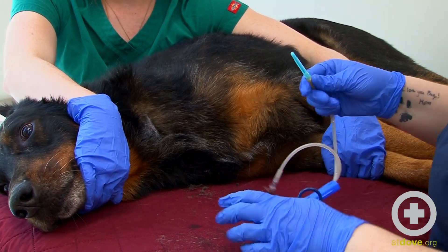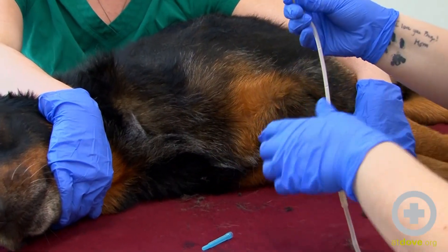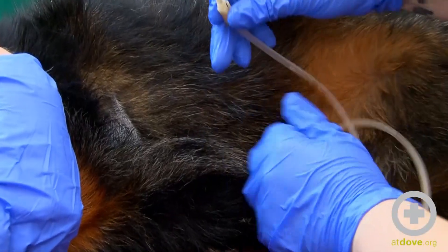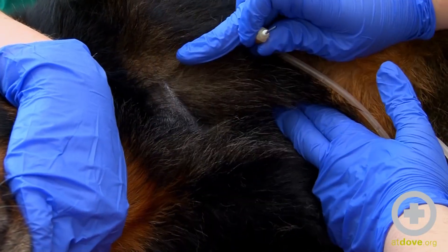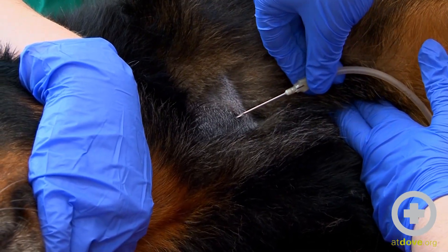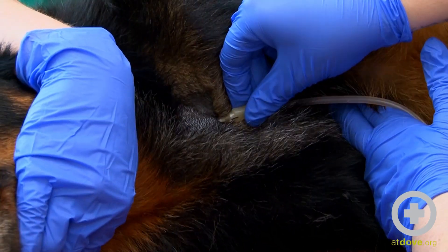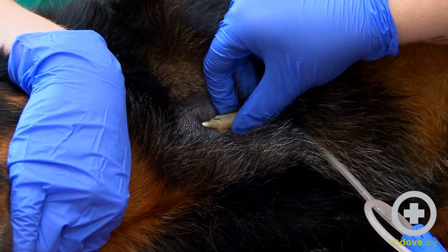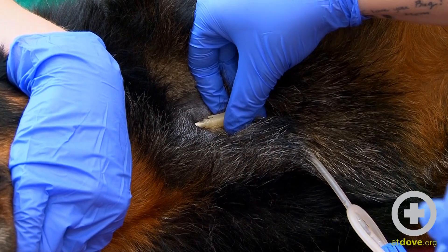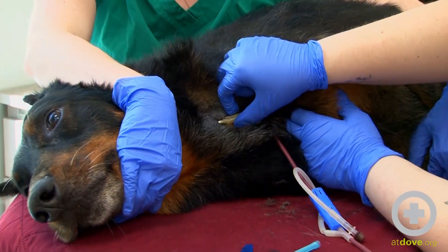Once we're ready and you know your clamp is secure, you can go ahead and take the needle off. We're going to use this bevel up. Good boy. Palpate the vein once more and then go at a 45-degree angle. Introduce the needle to the vein, and once you think that you're in, you can remove the clamp. If you're in, the blood should flow nice and freely.